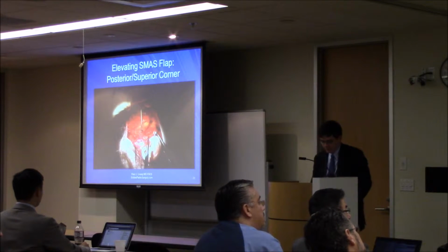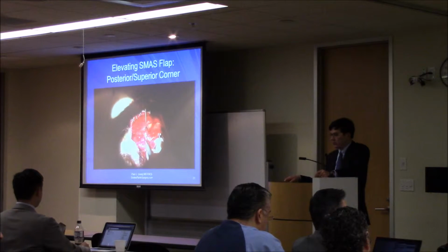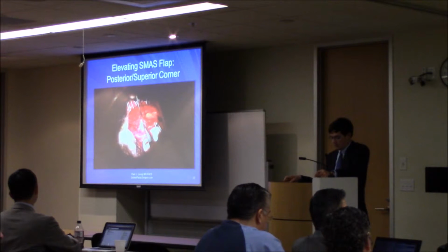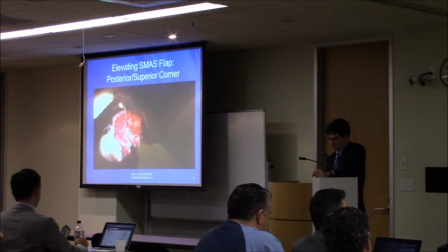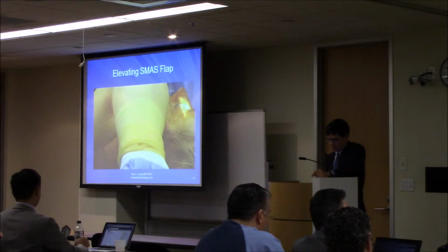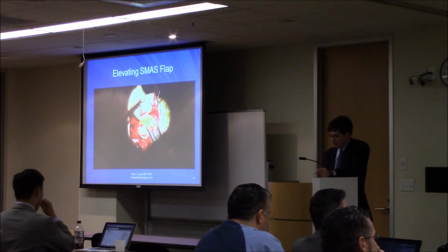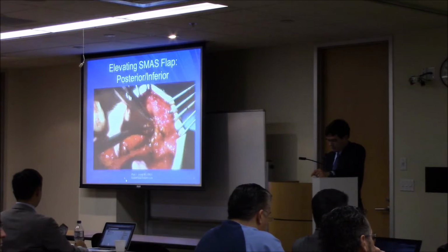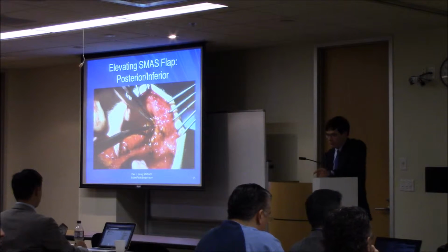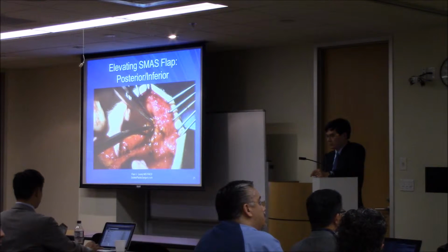Okay, and then after we make that incision, this is me starting in the superior posterior corner and elevating the SMAS. Anybody could do this. More of the same, just continuing to elevate the high SMAS component of the flap, and that's then here a few minutes later. And then in the posterior inferior portion, I'll talk more about this extended platysmal component, but I don't know that I go 6 centimeters below the mandible; I probably go 3.5 to 4 centimeters below the mandible routinely.